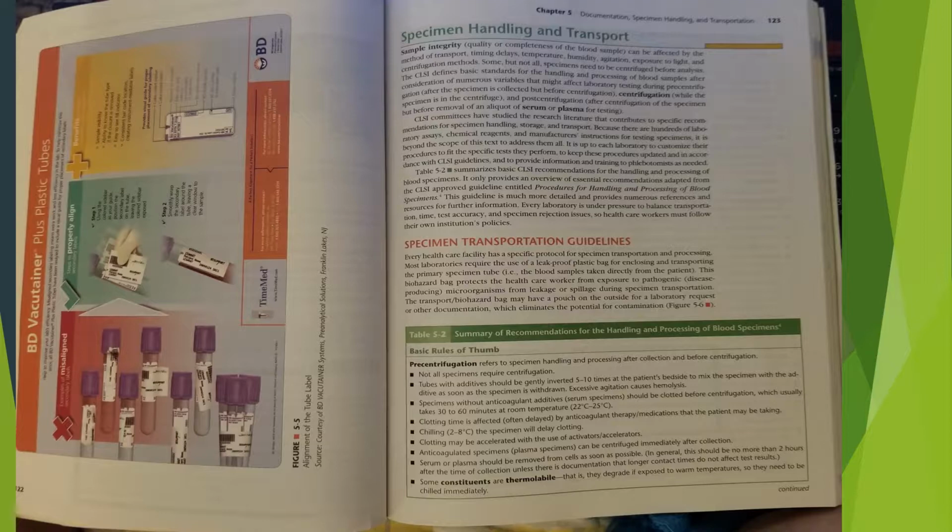Specimen handling and transport. Sample integrity, or quality or completeness of the blood sample, can be affected by the method of transport, timing delays, temperature, humidity, agitation, exposure to light, and centrifugation methods. Some, but not all, specimens need to be centrifuged before analysis.